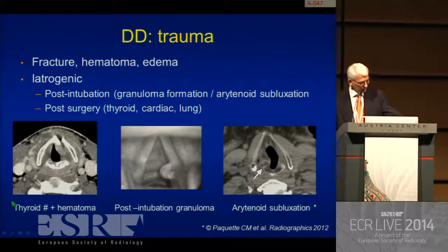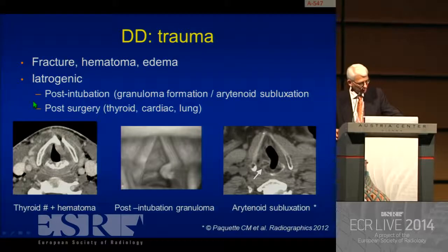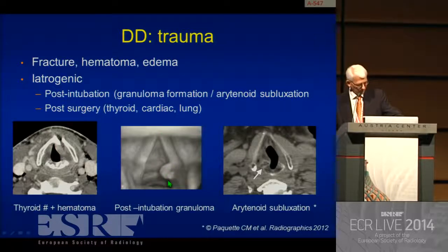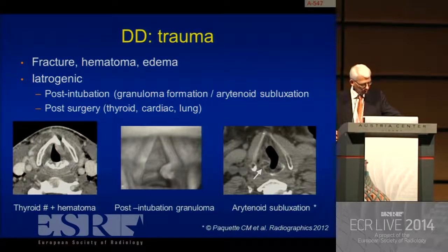Trauma can cause hoarseness. This is a patient with a fracture of the thyroid — you see this high-density area anterior in the left vocal cord, a hematoma. Of course this cord cannot move normally. There are also iatrogenic causes of trauma, especially post-intubation patients, where you can have granuloma formation. And if you have a direct trauma during long-time intubation, you can get arytenoid subluxation — an abnormal position of the arytenoid, abnormal position of the vocal cord. Other types of surgery can cause damage to the recurrent laryngeal nerve, especially thyroid, cardiac, and lung surgeries.